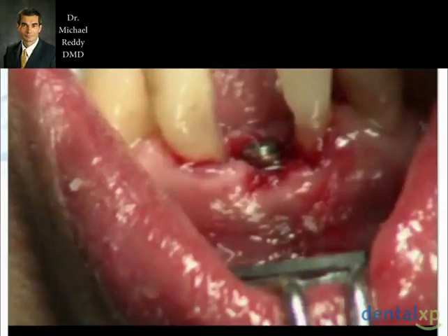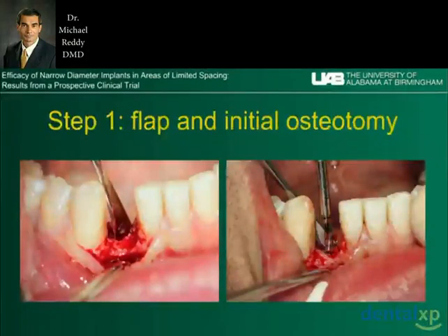And so that certainly is something that you can use. I'd probably give yourself a little more than 5 minutes the first time, but maybe 15. But you can certainly get to the point where you can be in and out of one of these cases in 15 minutes pretty easily.